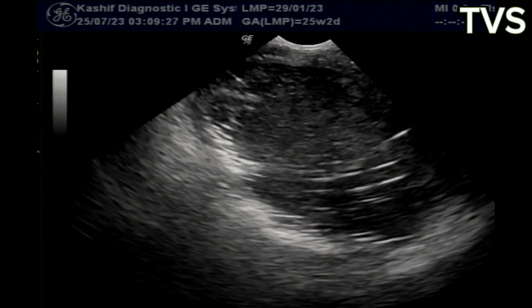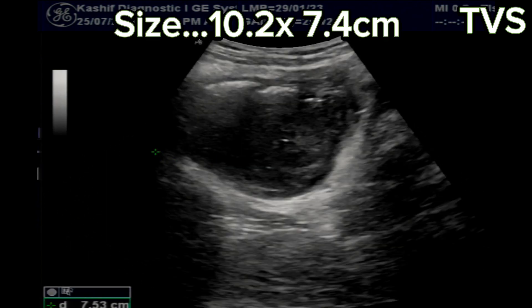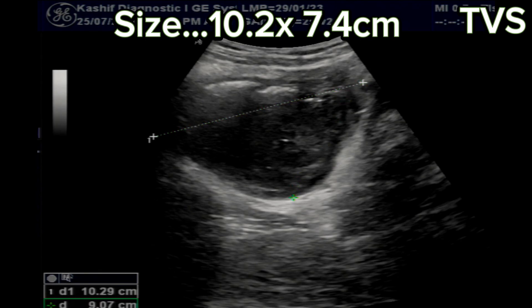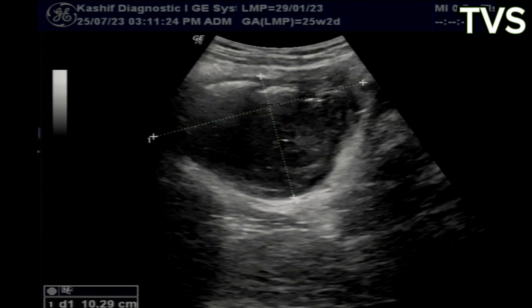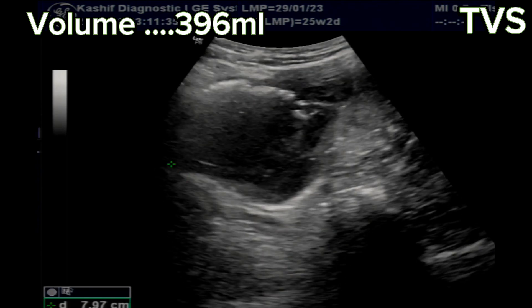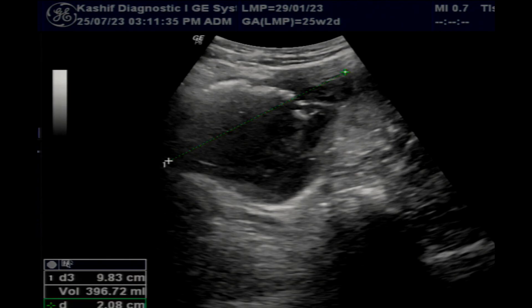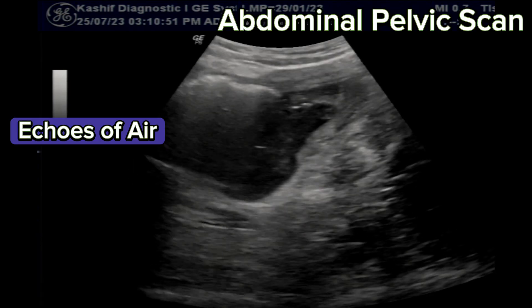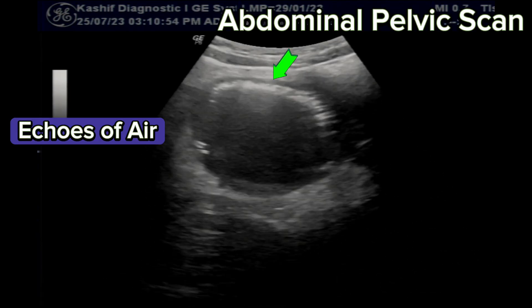There is no internal vascularity. The abdominal pelvic scan is done. We can see a large cystic mass of size 10.2 cm and volume 396 ml. The abdominal scan gives a more clear view of echogenic echoes of air with dirty shadowing.